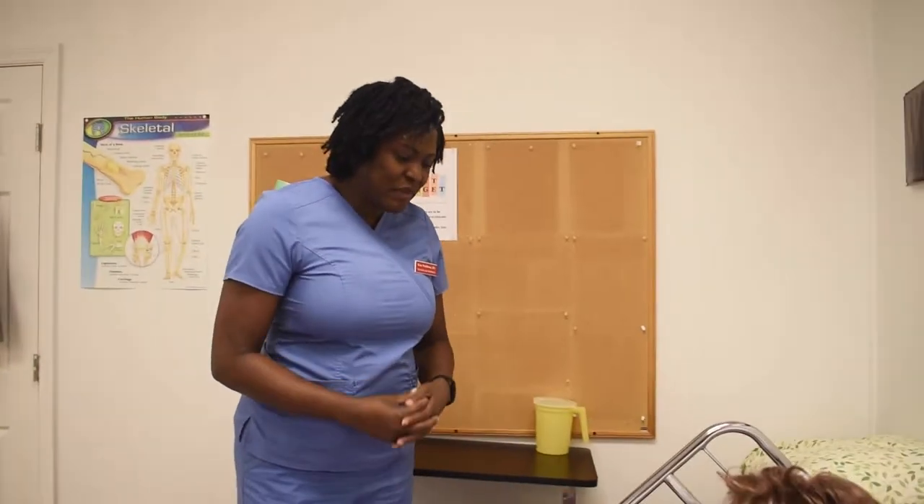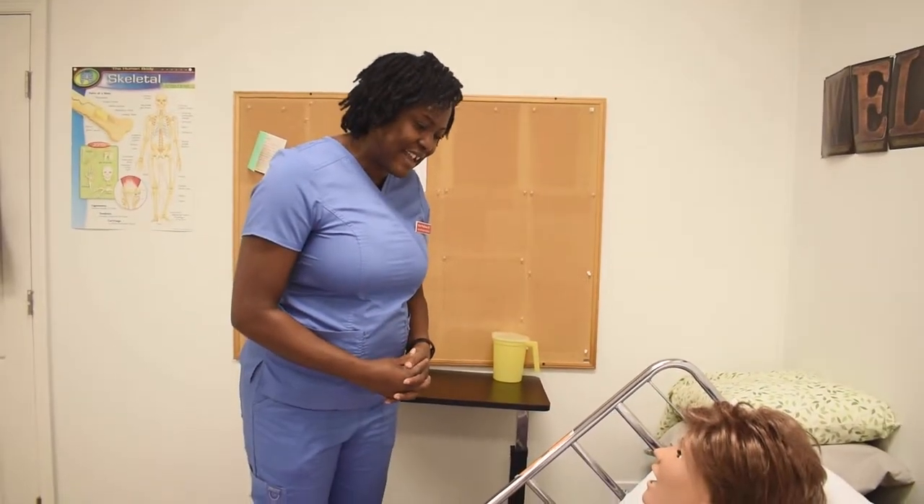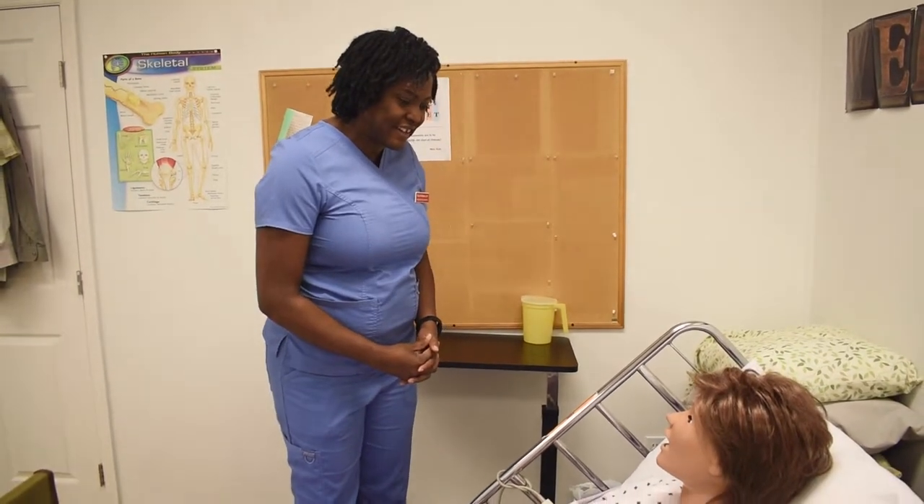Good morning Ms. Trixie. I'm Kim, your CNA for today, and today I'm going to apply your elastic stocking.